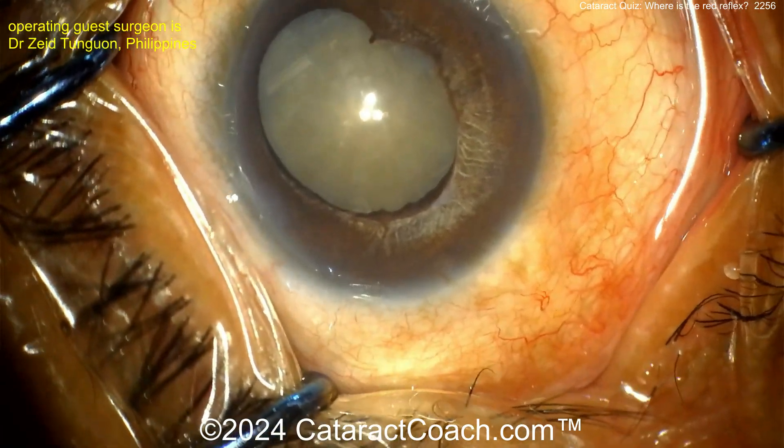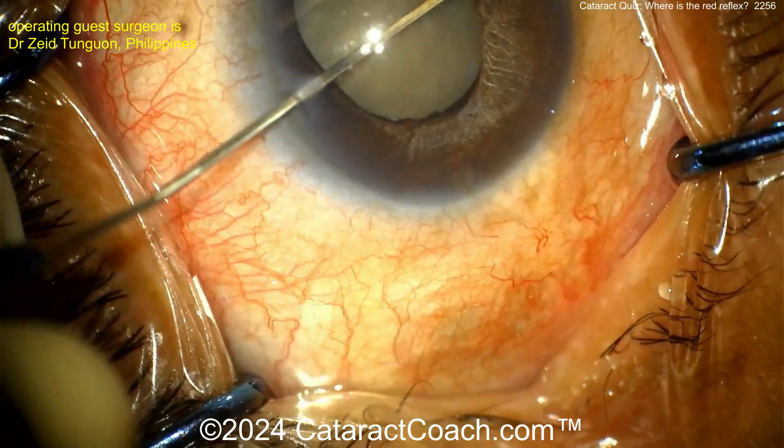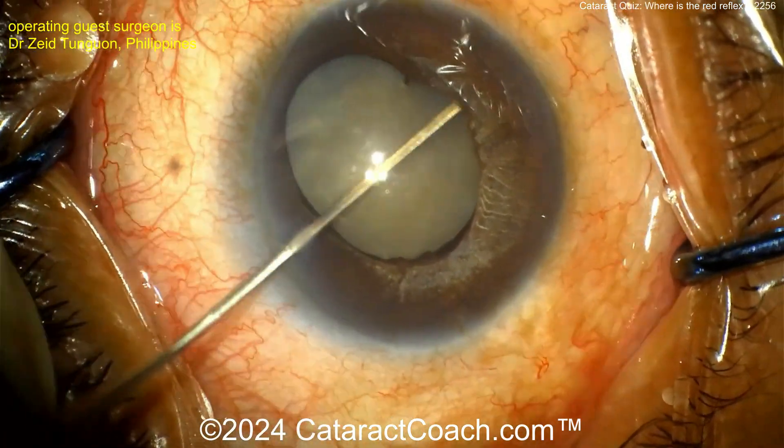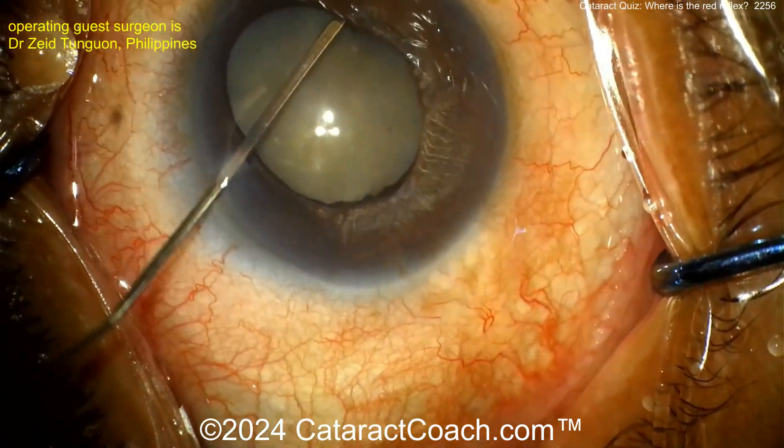In the eye you can see some synechiae, some iris atrophy — it's a pretty dense cataract. Putting in a spatula to help break the synechiae. Let's take a look and see what we've got here.